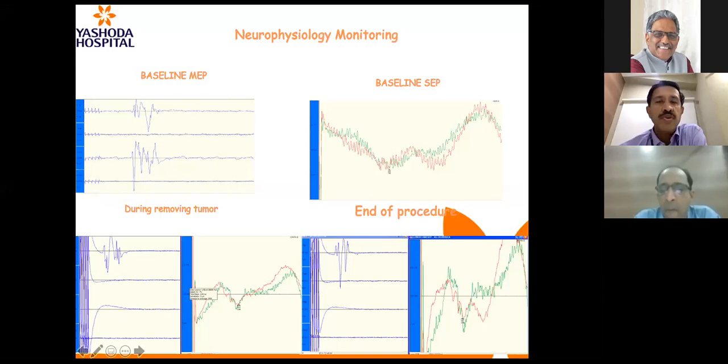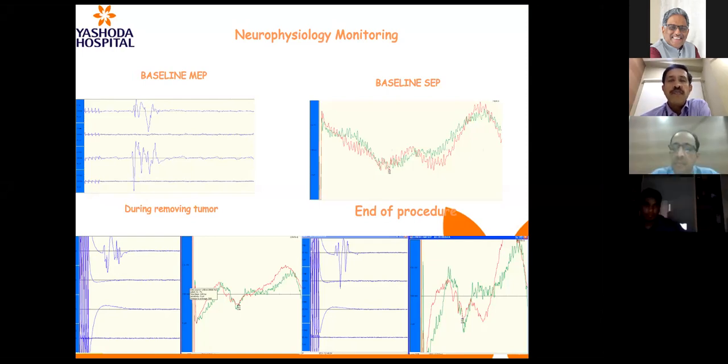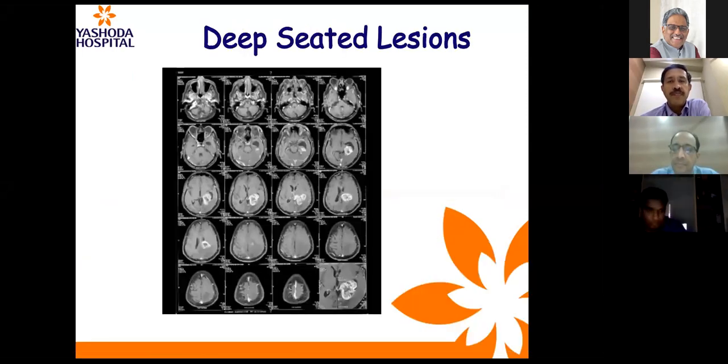of the procedure. So integrity of this conductivity, even though visibly you're preserving them anatomically. So that is one concept as students we need to learn early enough, that anatomically preserving a neural structure is not equal to functional integrity being maintained. And that can only be assured if there is a good neurophysiological monitoring.